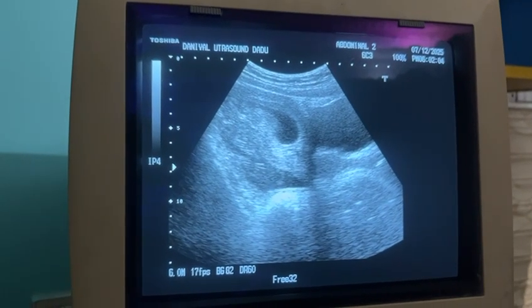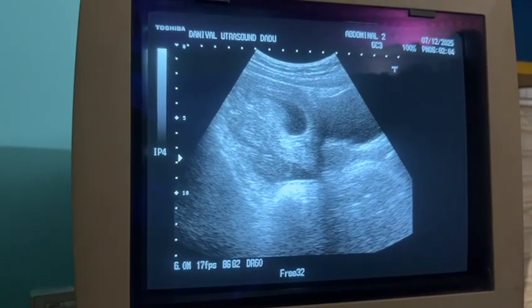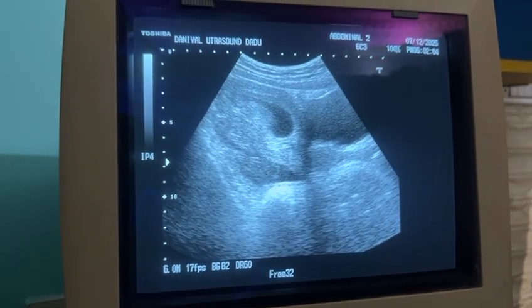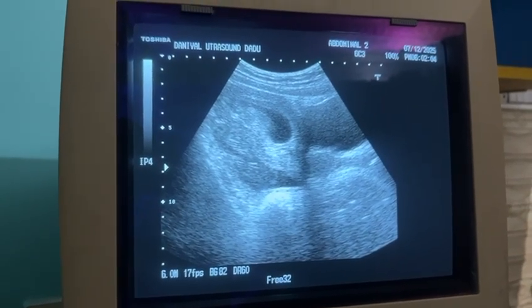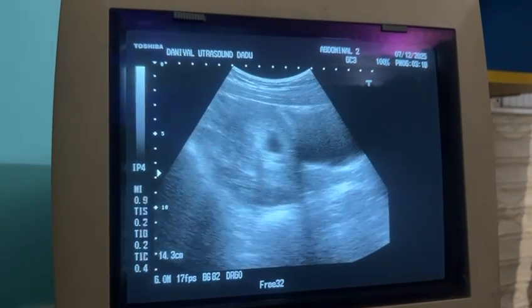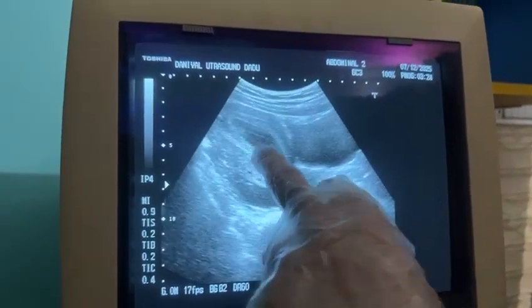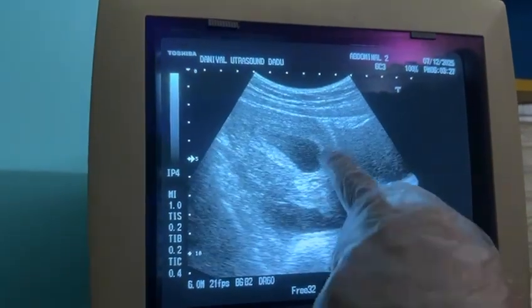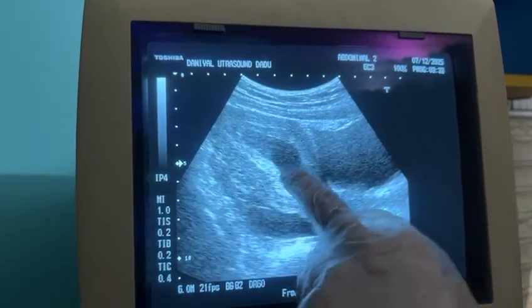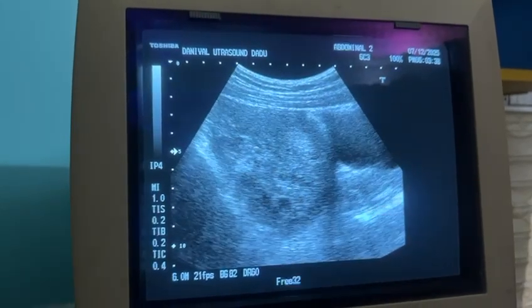And here I would show you a few sonographic features so that people who are interested can understand how to diagnose it and how to get the typical findings. So on ultrasound, especially with a positive pregnancy test, we can observe here, you see, here is the uterus. It shows a slight amount of fluid inside, but this is not a gestational sac. This is a decidual reaction with stromal edema showing fluid. The real pathology lies behind the uterus here.